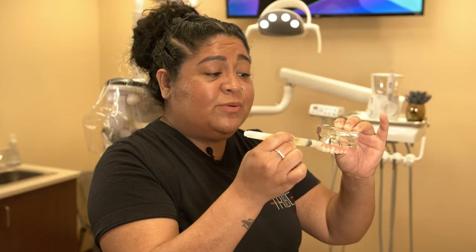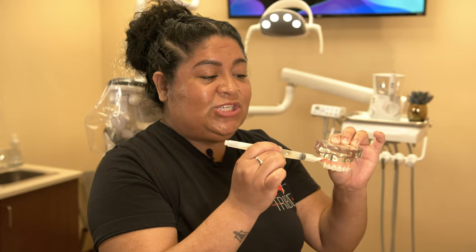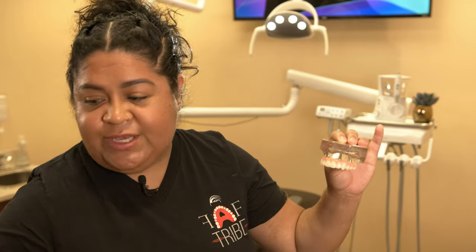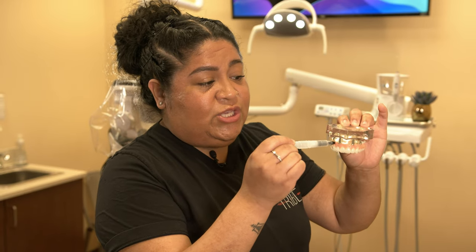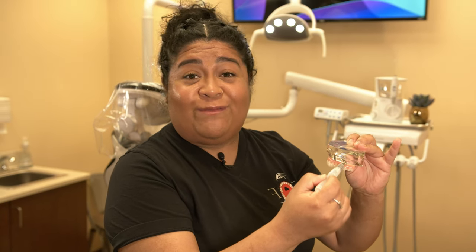This is not meant to replace a Waterpik or your brushing — it's just an on-the-go option. You have many options with different tip sizes; find whichever fits and you're more comfortable with and go with that one. Brands do not matter — do not get anything expensive because they're all going to do the same exact thing and will last you a very long time.